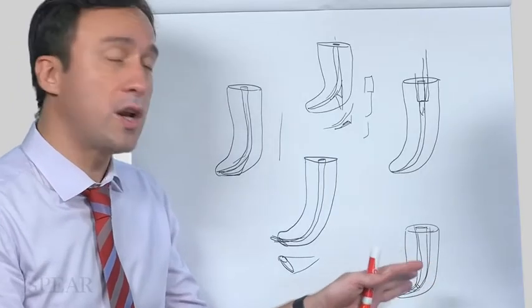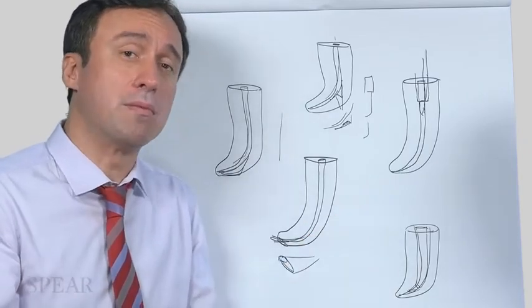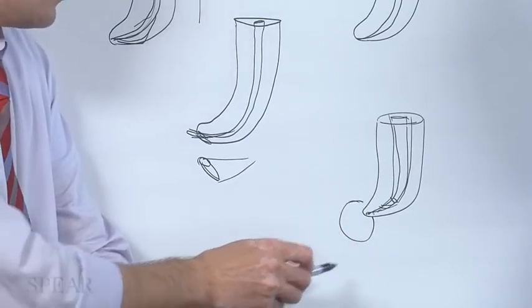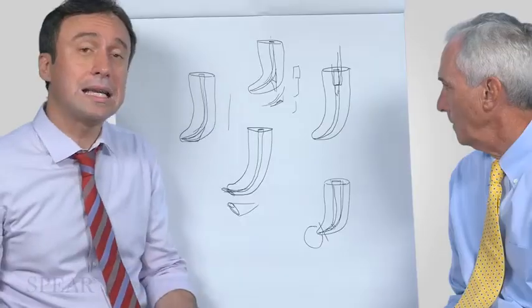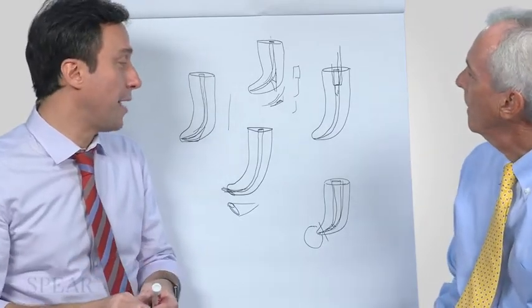Those cases, depending on the situation under which the file broke, if the canal had already been cleaned completely and then it broke, or how much bacteria is remaining beyond here, and what it's going to cause. It's going to cause an infection or not. Then the situation would be you have to do surgical retrieval or an apicoectomy to address it. Or if it's already been cleaned, sometimes you get away without having a problem and you just leave it as is, and it's not an issue.